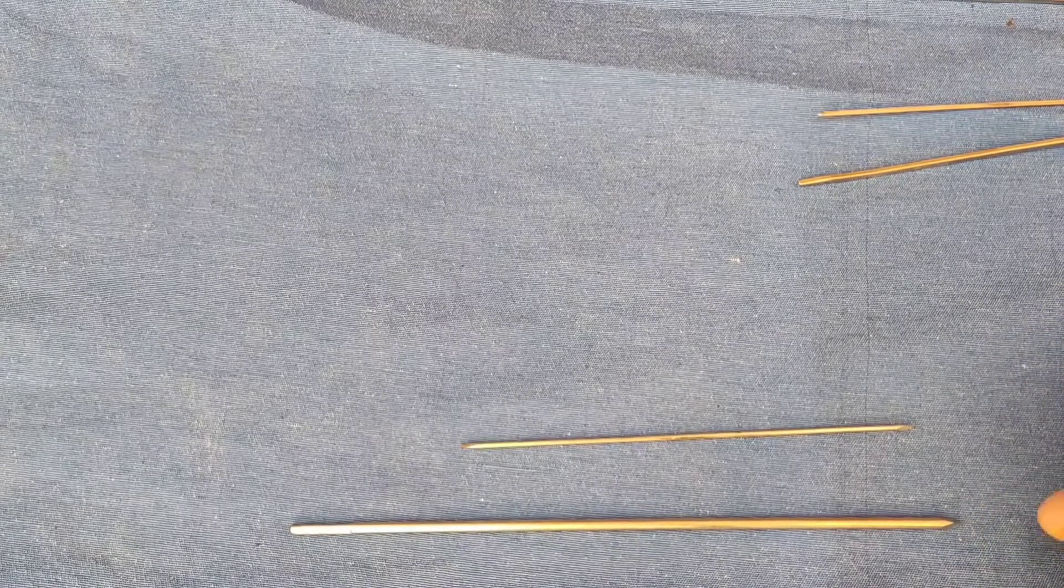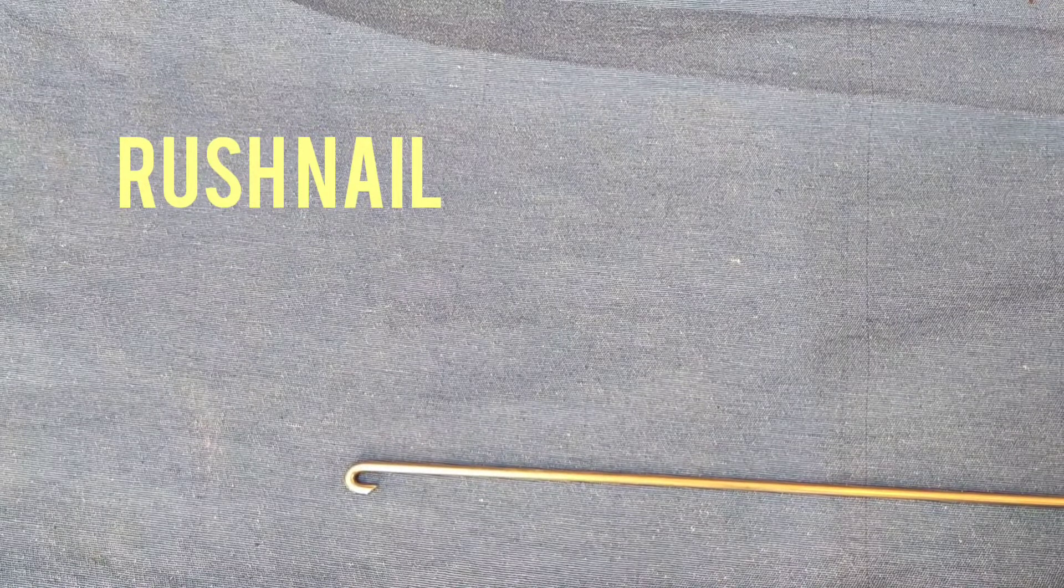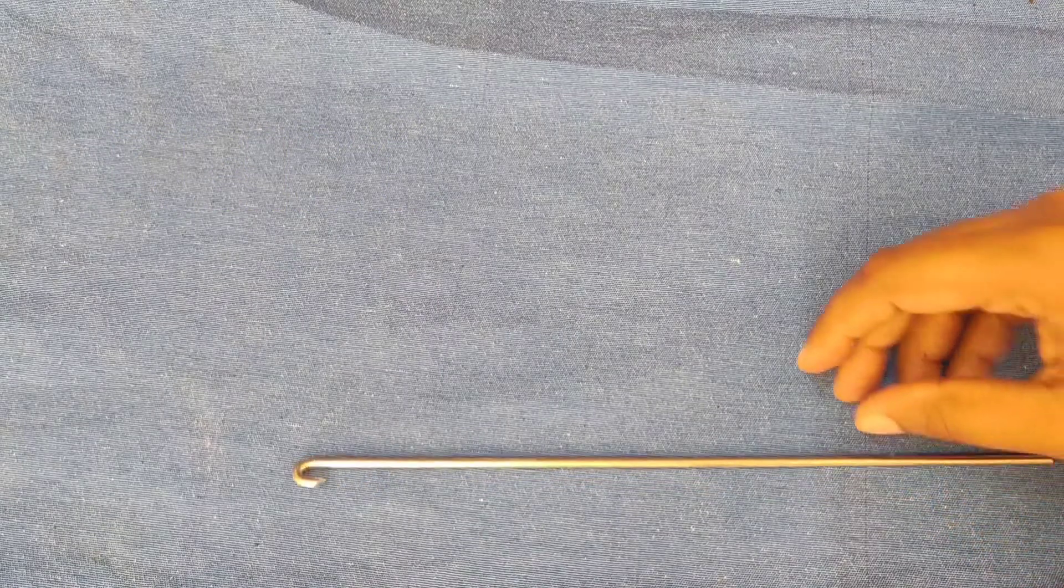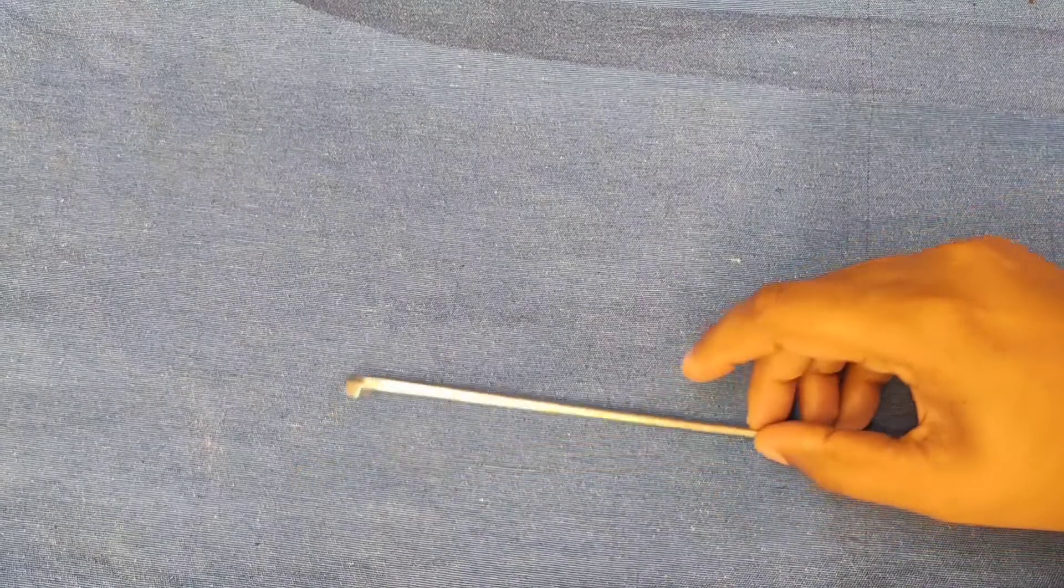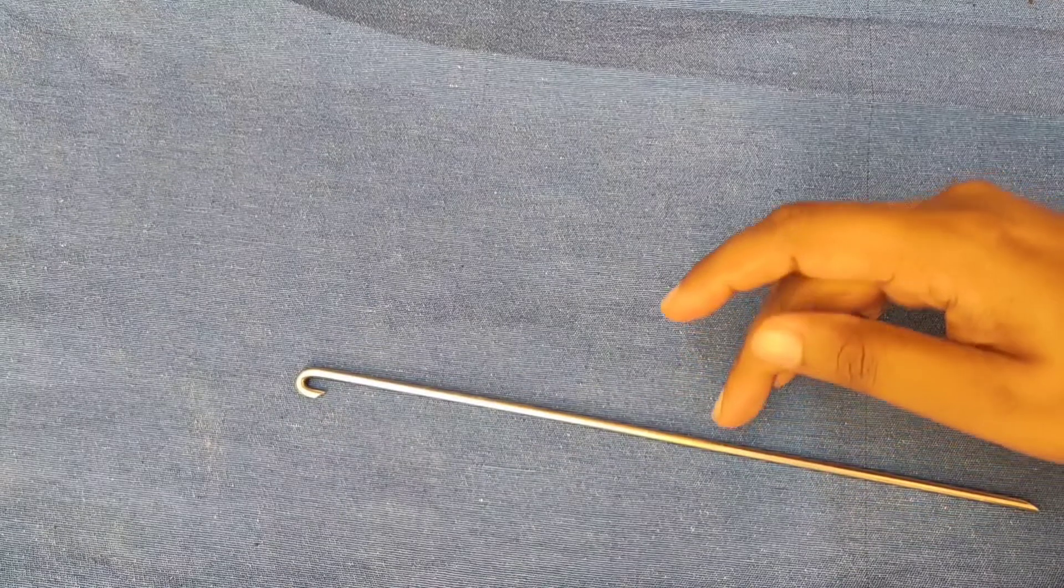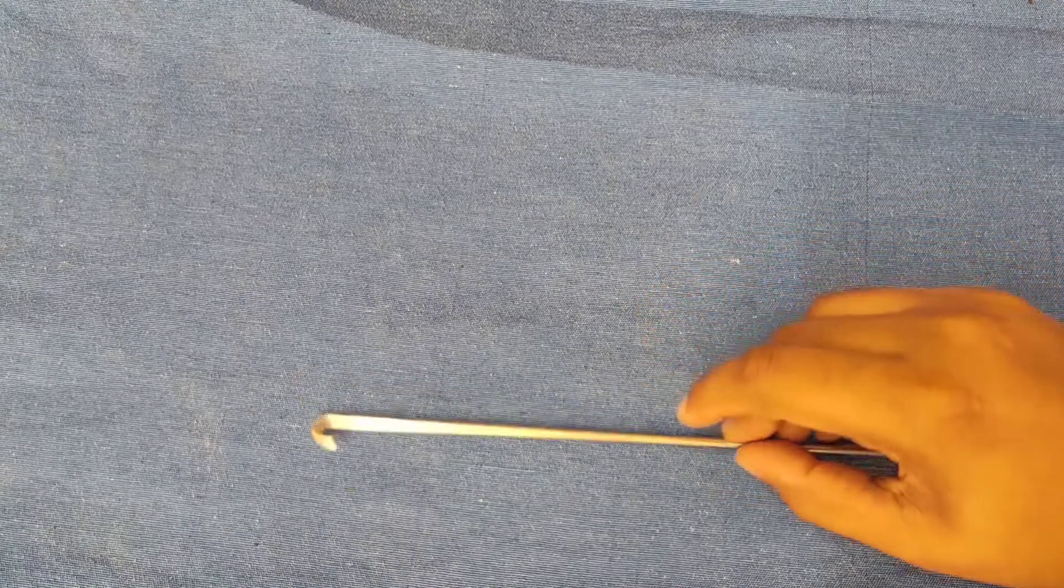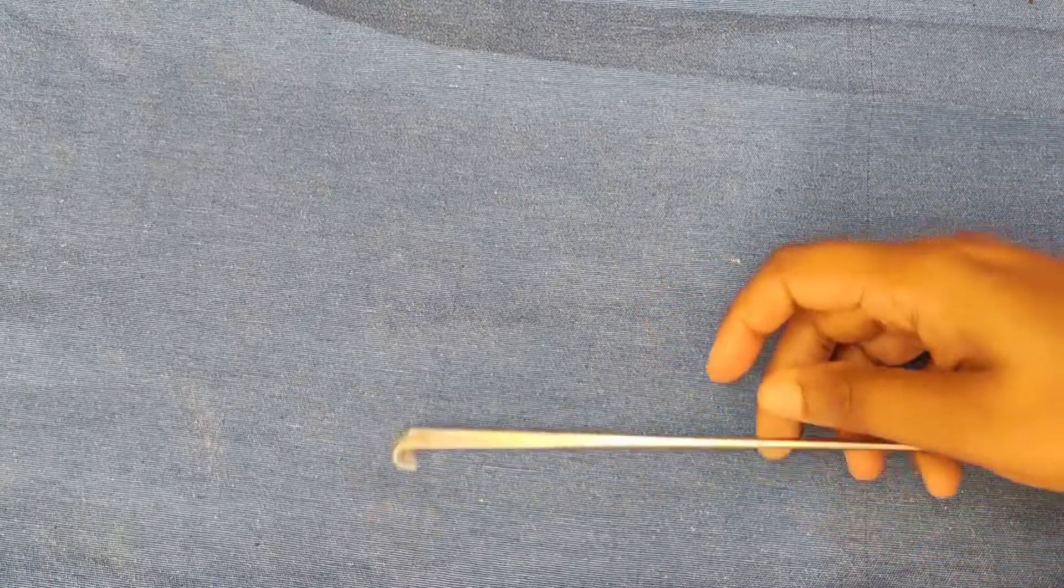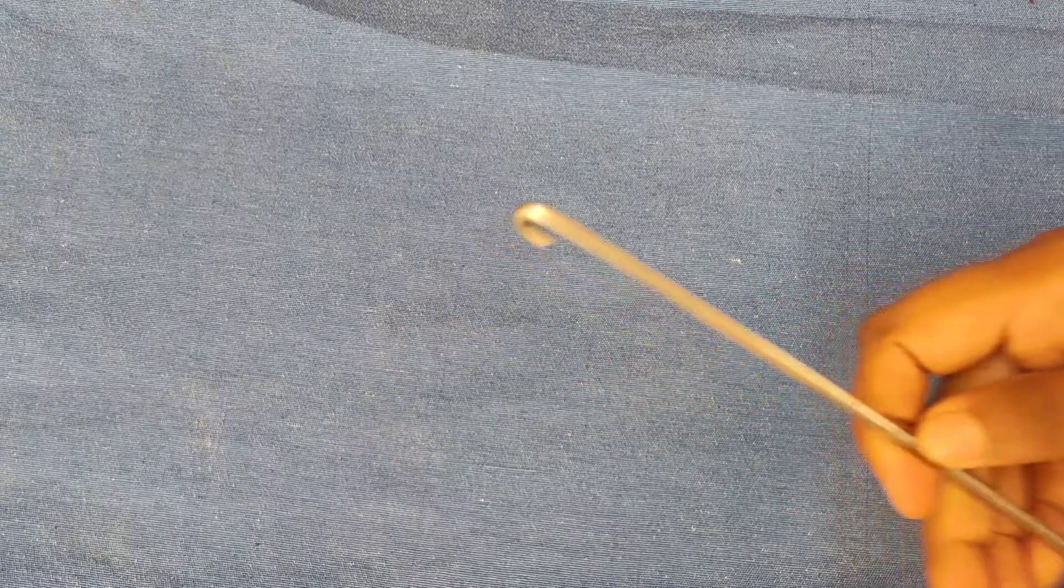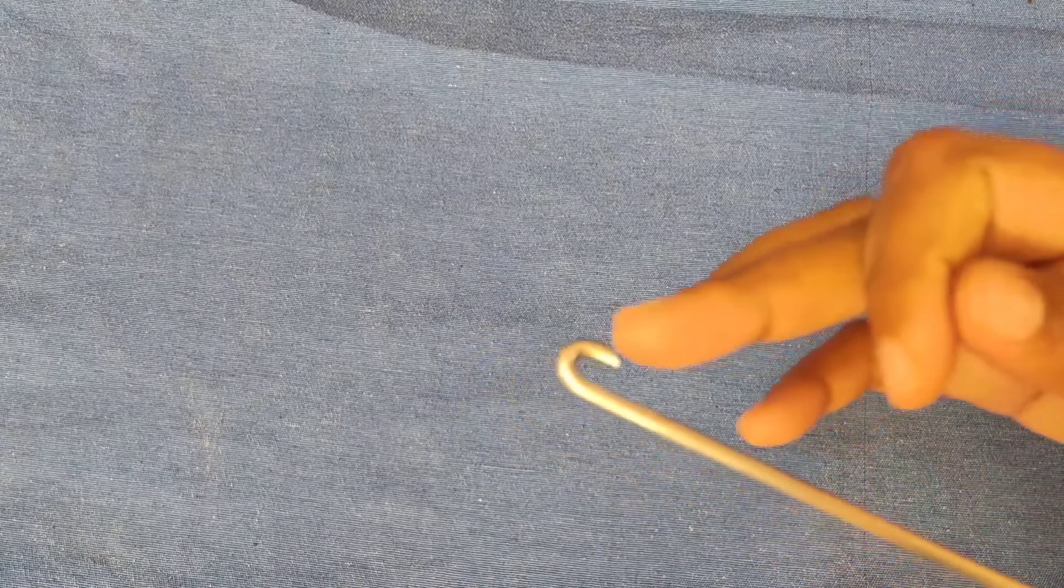Next is Rush nail. It is a centro-medullary nail. It has a hook end and a beveled tip. One end of the nail is hook shaped and here you can see one end is hook shaped and it has a cylindrical shaft, a rounded shaft and a beveled tip.